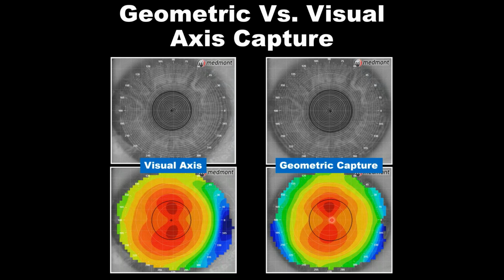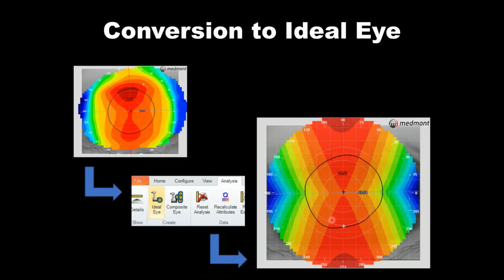You have an understanding of natural eye displacement. Now, when we want to build an orthokeratology lens, we talked earlier that an ortho-K lens needs to be built to microns of accuracy. We attempt to construct our ortho-K lenses to be 7 microns away from the eye, maybe 5 microns away from the eye, maybe 10 microns away from the eye. But within microns is what we're shooting for. So we want as little error as possible.